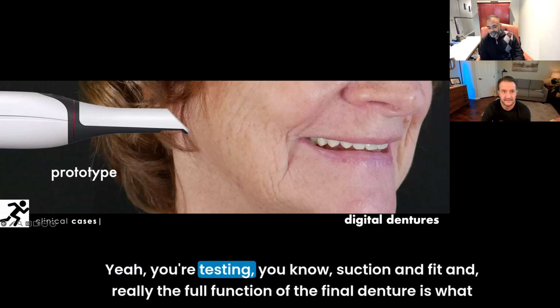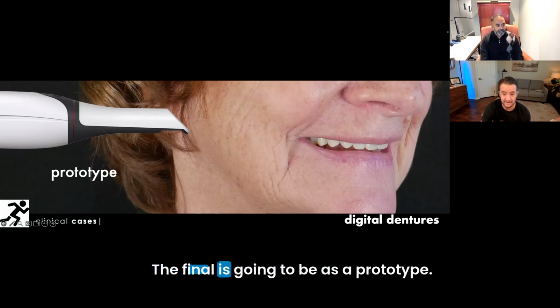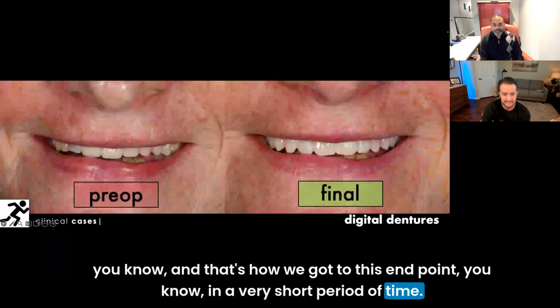Yeah, you're testing suction and fit. Really, the full function of the final denture is what you're testing in this prototype. It's everything the final is going to be as a prototype. It's just not in the same type of material that the final is going to be. And that's how we got to this endpoint, in a very short period of time.